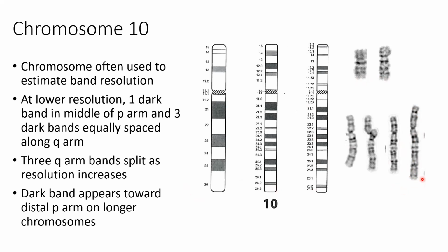So it's a syndromic deletion, but this is one region that we really look for when we're looking at that. But these 2 bands right here equal that one. And then this one, you're beginning to be able to see right there, these bands in here, and then this group of bands represent this part of the 10.